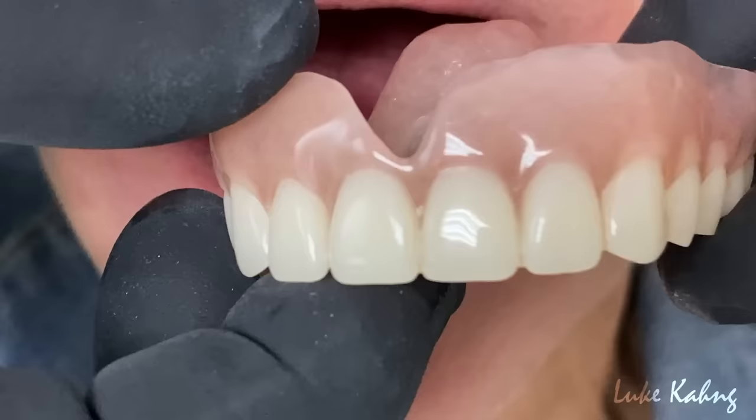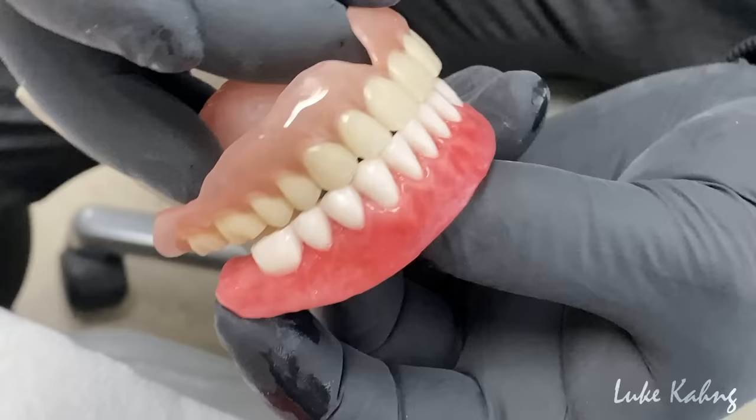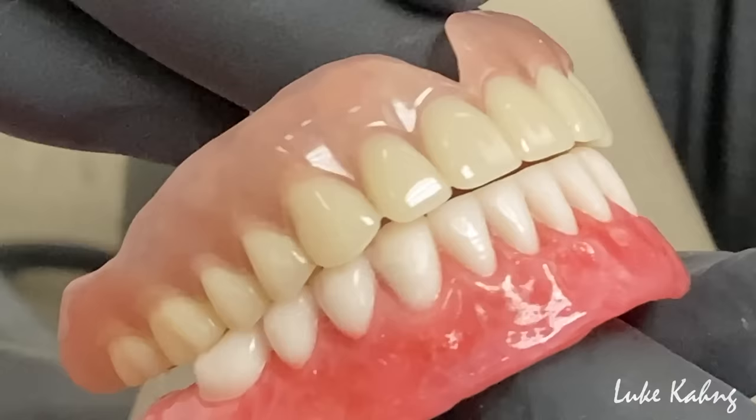She also doesn't like the color on this. You see, look at the color. Look at what they did here. And this is supposed to be her final. So this is what I always make, not this. You see the gums on top? This is no good.